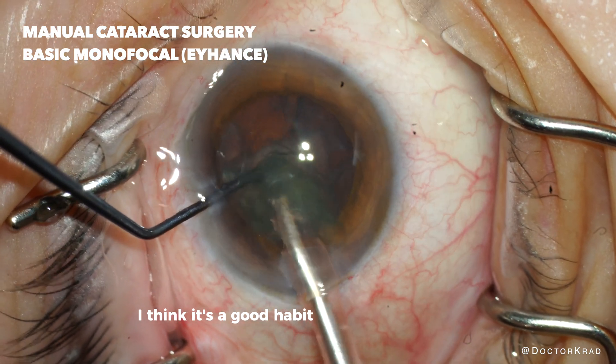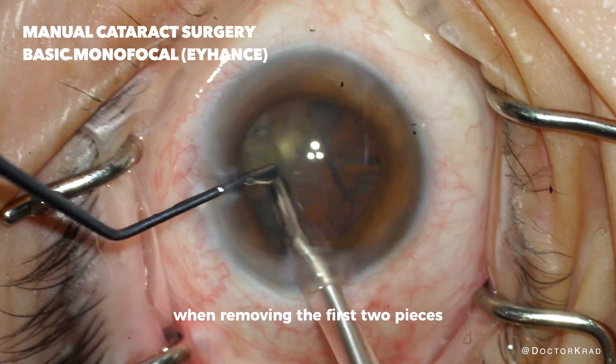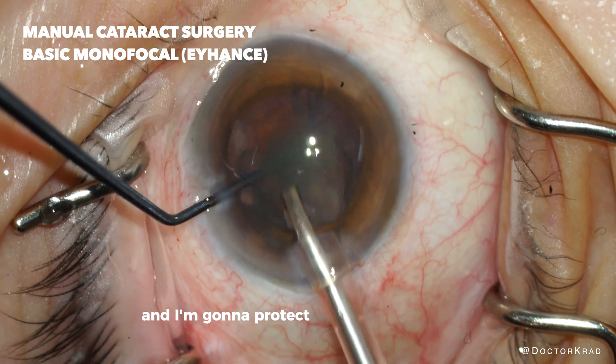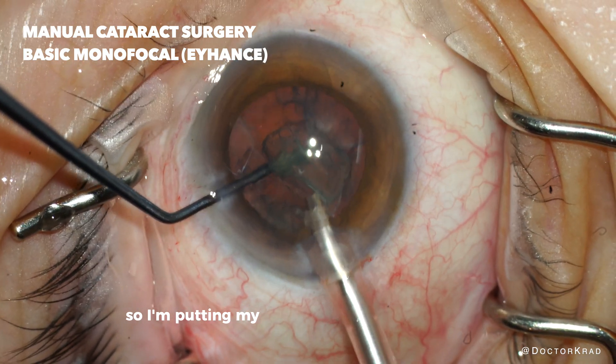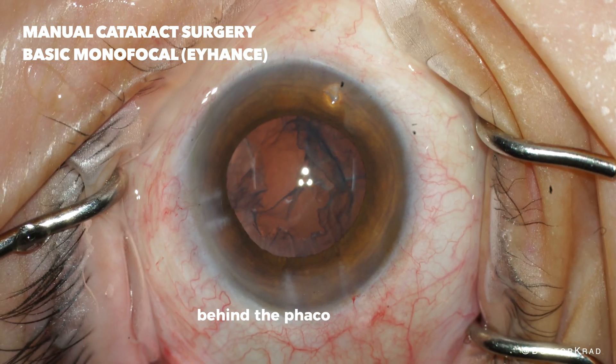I think it's a good habit to protect the cornea with your second instrument when removing the first two pieces. The final piece is going to come out now and I'm going to protect the posterior capsule, so I'm putting my instrument from my left hand behind the phaco instrument.